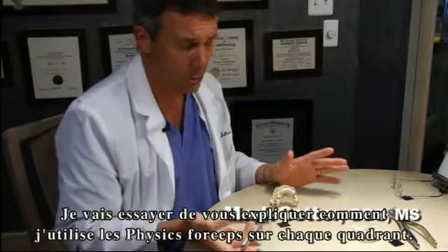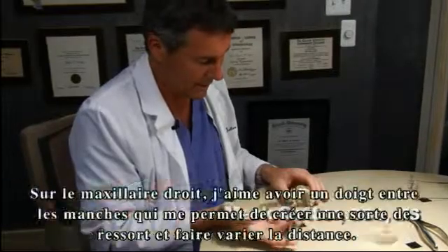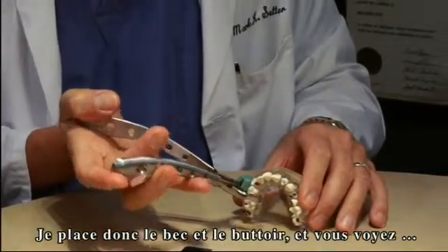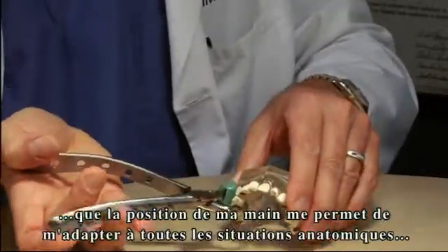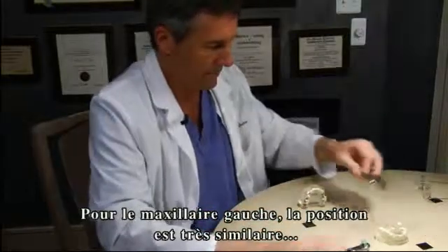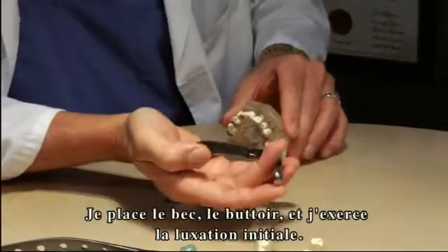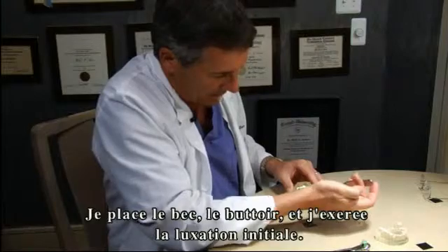In an effort to explain hand position in each quadrant, I'd like to show how I use the hand position with the forcep in the various quadrants. In the upper right posterior, I like to have a finger between the handles that acts as a spring, allowing me to vary the hand distance. In the upper right, I place the bumper, position the beak, and the hand position allows me to vary that distance as the anatomy determines, then provide the rotation pivot point. An upper left hand position is somewhat similar — a finger between the handles for variability of beak position — then positioning the beak and delivering the initial luxation with the pivot point.